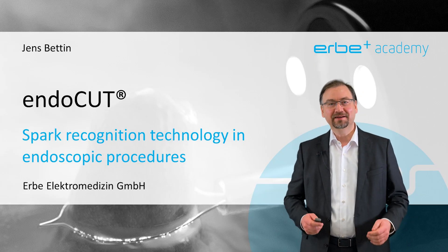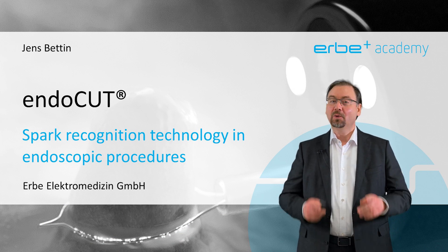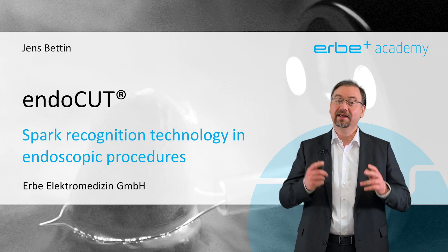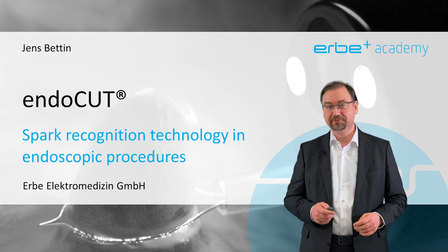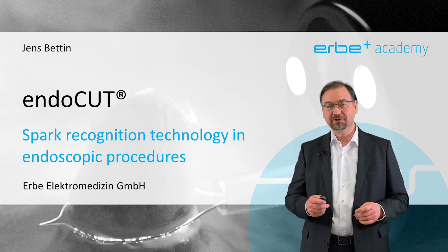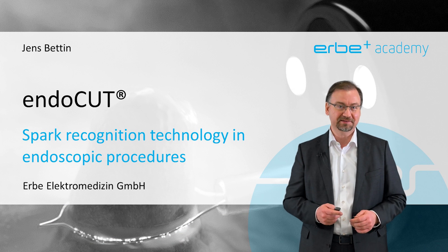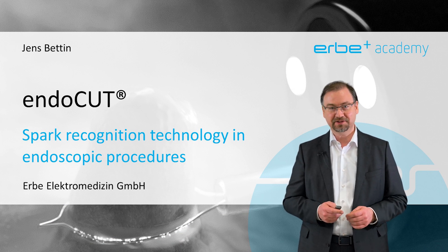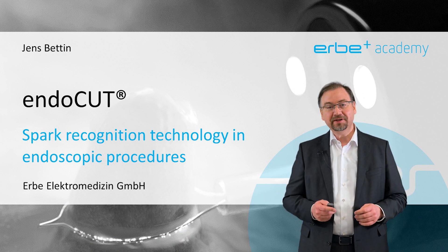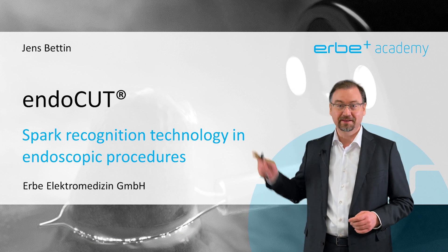The Endocut from Erbe is an advanced electrosurgical mode for endoscopic cutting. What makes it special is its spark recognition technology and that it can be adjusted individually in several ways. In this webcast I will show you how it works and how Endocut can help you overcome some of the typical technical difficulties in various endoscopic procedures. Become a master user of the VIO units and learn all the technical details about this special mode in this video.